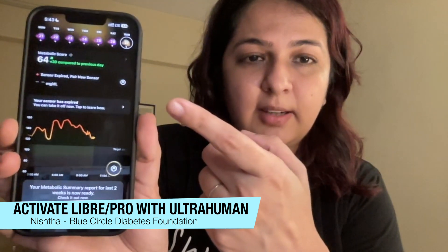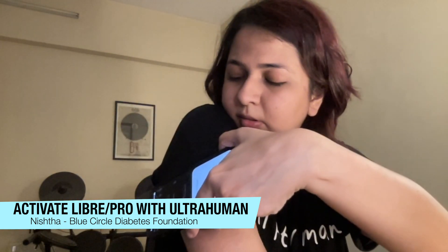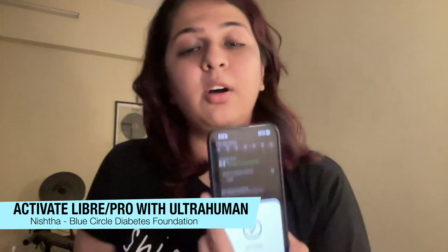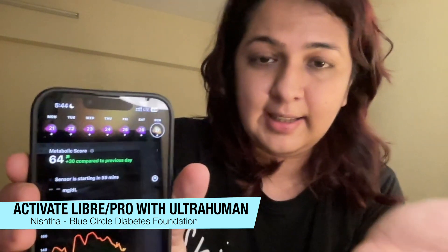Now what you need to do is take your phone and make sure the UltraHuman app is on. This says that my sensor has expired and I need to start a new sensor — you see this button here below, just click on this. You'll see a pop-up saying 'ready to scan.' Hold your phone right above the sensor and you'll hear a noise indicating the sensor has been activated. You'll also get a message saying 'sensor is starting in 59 minutes,' meaning you'll be able to start scanning within the next 59 minutes.